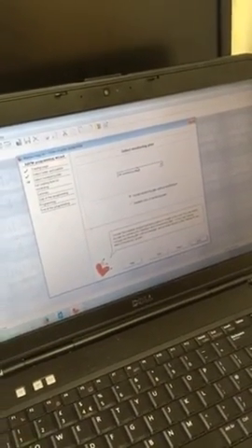So next. Now, you don't need to do anything with the monitoring plans. The UK monitoring plan is fine. That's readings hourly at night, 30 minutes during the day. Except without modification is already ticked for you, so you don't need to do anything here except tick next. Check the time is right, 3:45, indeed it is. Then next, this just is a summary of what's been said previously. Next.